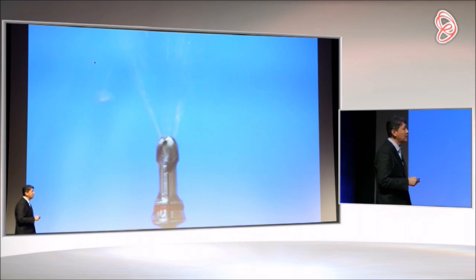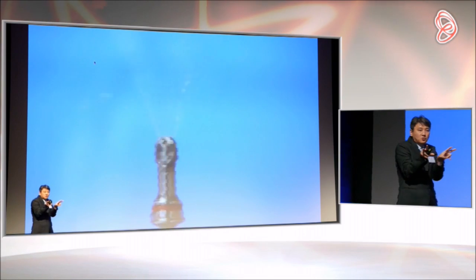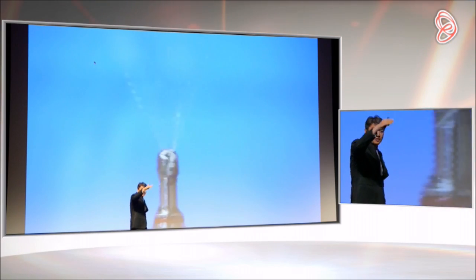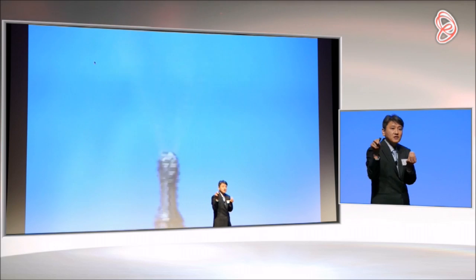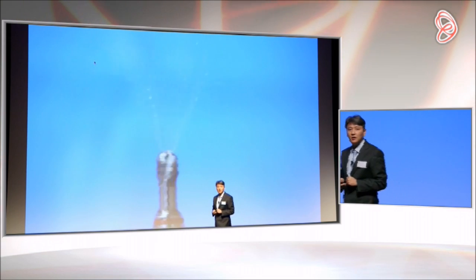And I recommend high pressure water. You can see the water is not coming from the middle, but from 4 holes on the side. Why? Because the sinus is never flat. Sometimes it's at an irregular angulation and location, and it is very critical that the water squirts from multiple directions so that you are protecting the membrane 100% as you are making your osteotomy.